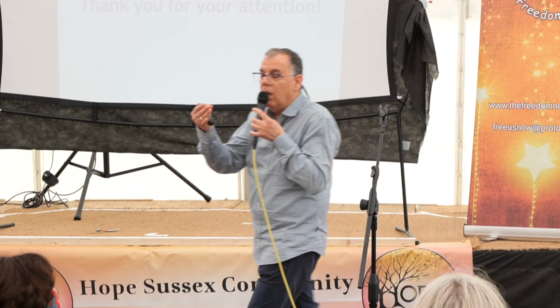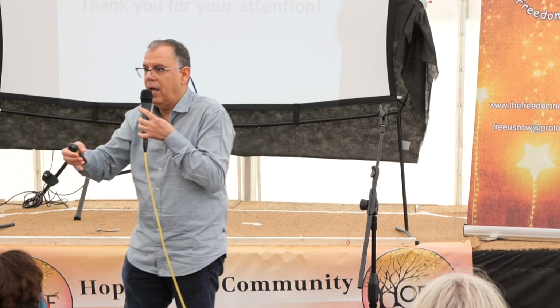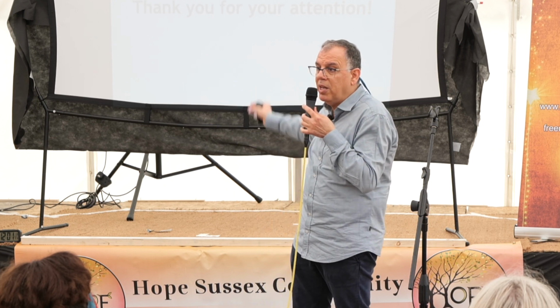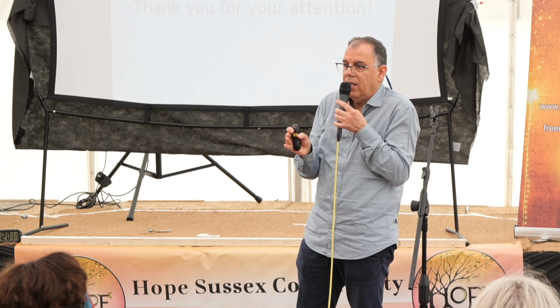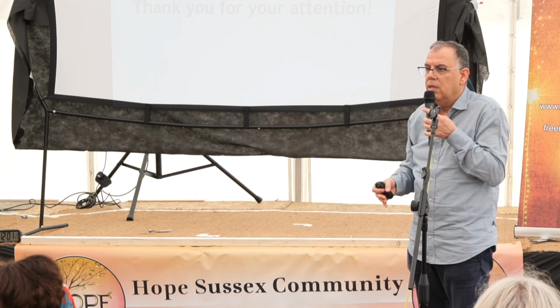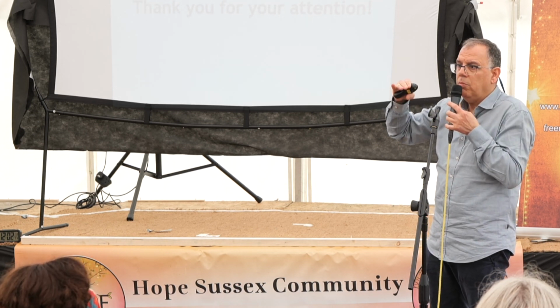Sorry about this. So the main advantage of using the laser, of treating gum disease, of doing the bone cyst healing, of doing the disinfection inside the root canals, and so many applications we use it for, is that at the end of the day, it's much cheaper than going to more invasive treatments, like having an implant afterwards, rather than keeping the tooth inside your mouth. So, if you balance it, it will be much cheaper.